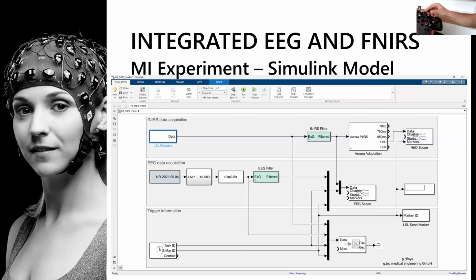When mounting them, so this is a short source. We just have to put in here the electrode, the source, and then put a holder on it. Of course, this is done via a montage in Aurora.